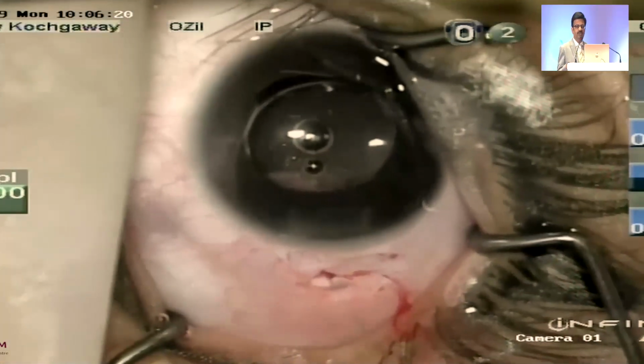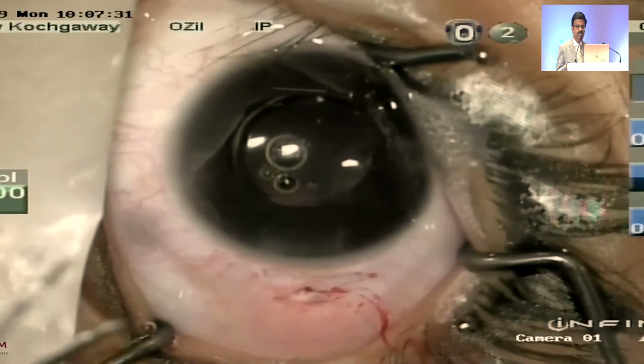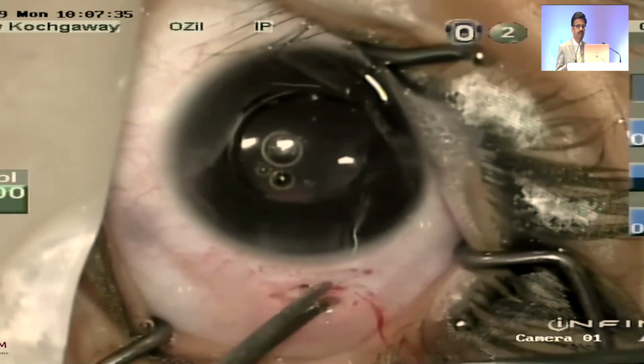This is one option, but it has the risk that slightly more manipulation can tear up the bag totally, and the whole thing will become unstable.